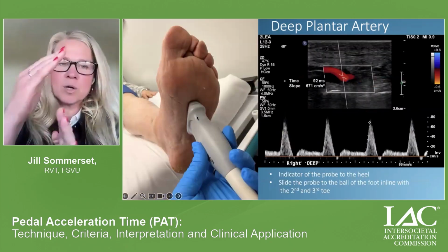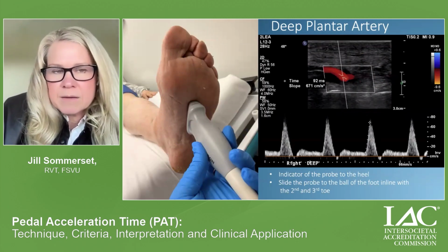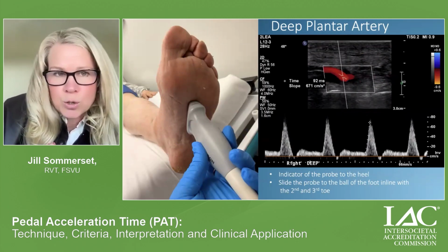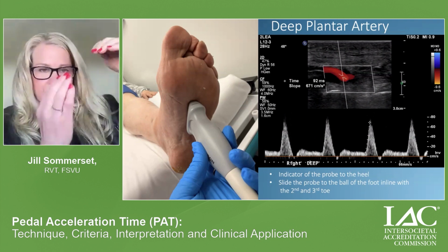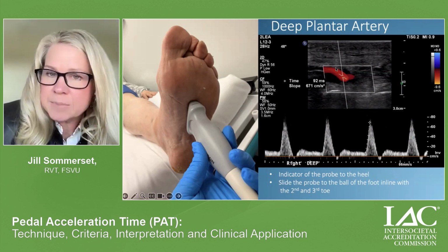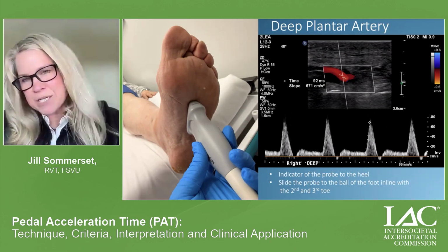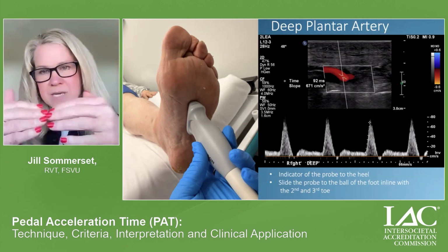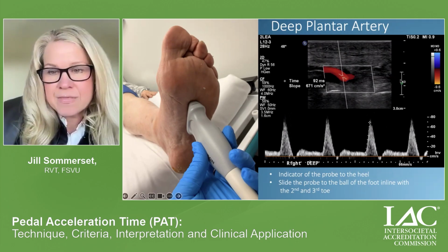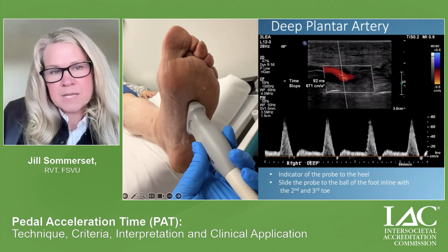And then we're going to slide the probe more towards the ball of the foot between the second and third toe. Because remember that pedal arch connects to that arcuate artery on the top of the foot. And the deep plantar artery is just, it's like SFA to pop. It's just a continuation of the vessel that's going to then meet the arcuate artery. And this deep plantar artery is going to dive.